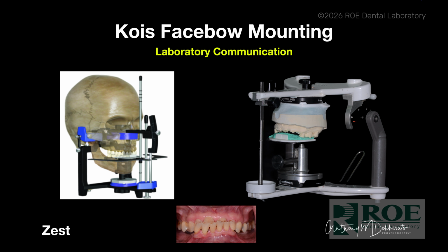and this is going to introduce additional problems in the occlusion of the case when we go to seat the case. Just as important to me is taking a face bow because this places the maxillary arch in the proper orientation to the skull. It gives us an average dimension or average measurement from the TMJ to the incisal edge position. And it also places the patient's jaw in the correct horizontal position so that when we're working on the articulator or when it's at the lab, we're not introducing cants to the incisal edge, and we're really greatly improving the ability to have a nice occlusion when we go to seat these cases.